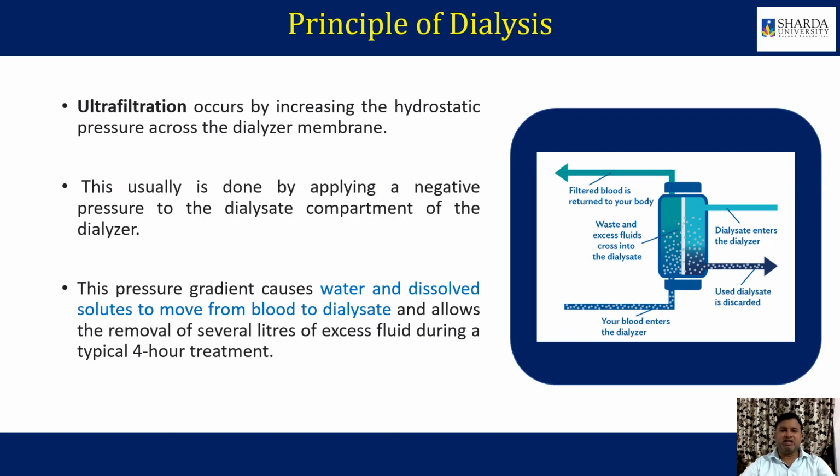The other principle is ultrafiltration, which requires hydrostatic pressure. That can be achieved by applying negative pressure to the dialysate compartment of the dialyzer. This pressure gradient removes water and dissolved solute from blood to the dialysate and allows the removal of several liters of excess fluid during the 4-hour treatment. So for dialysis, 4 hours is needed.